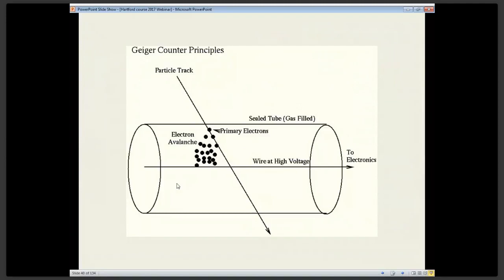Geiger counter operates by a total avalanche effect. One photon comes into the Geiger tube. The Geiger tube is gas under pressure. And because there's so much pressure within that tube, and the voltage is so high, up to 900, 1,000 volts in a Geiger tube, that one photon causes an ionizing event that creates a whole avalanche of events, and you get this big spike of a reading. So the Geiger counter is constantly turning on, turning off, turning on, turning off at a very rapid rate, and is exquisitely sensitive to even one photon.